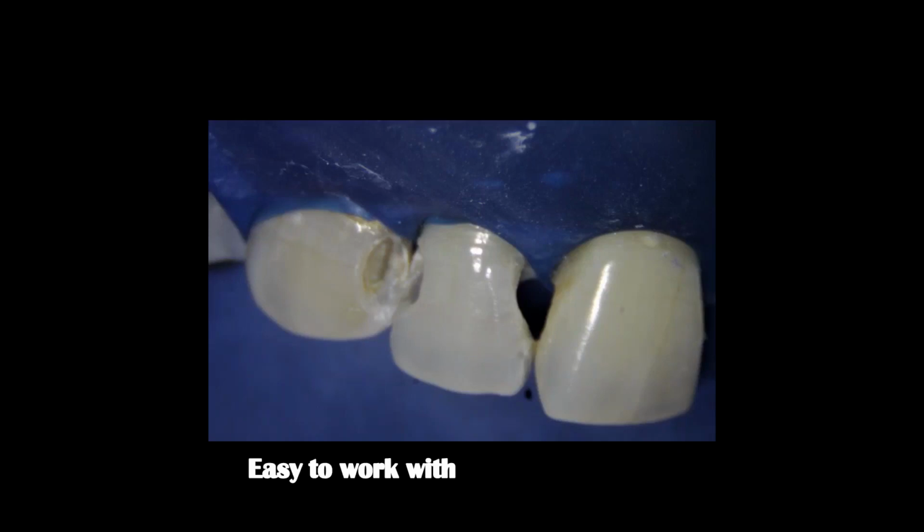The medium sheets are great for beginners because they are light, they're easy to work with, and they are excellent for single tooth isolation. You will take less than 1 minute to perform a single tooth isolation. But if you were to attempt quadrant isolations, it is prone to tearing, and it will not be able to give you that kind of moisture control and tissue retraction which you can achieve with a heavy sheet.